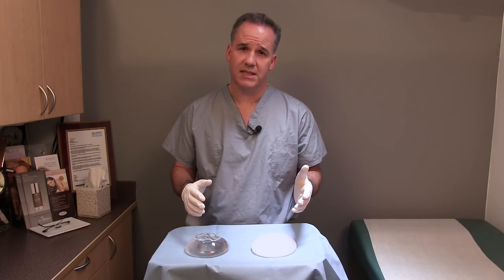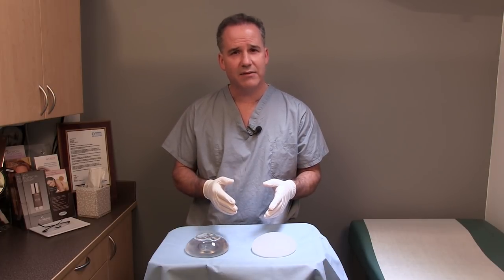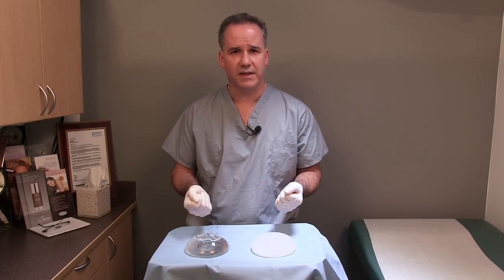So I thought it would be interesting to see exactly what it is that's inside these implants and to cut them in half to see exactly what we find.